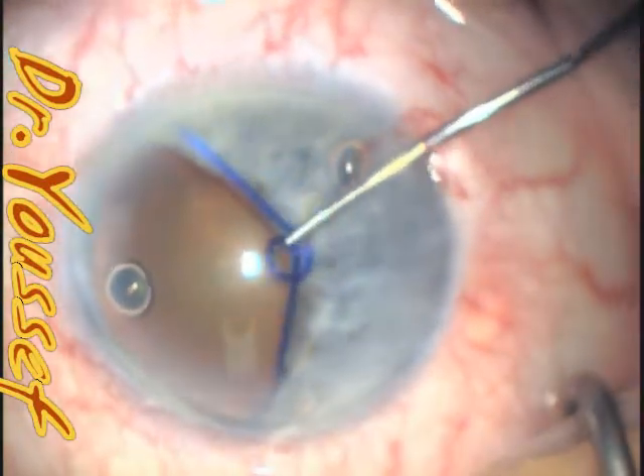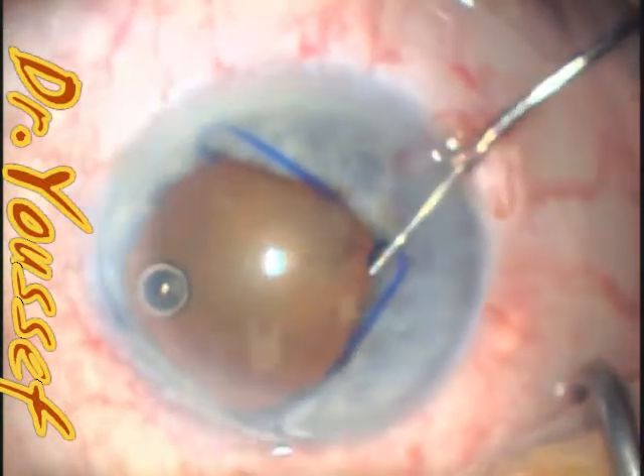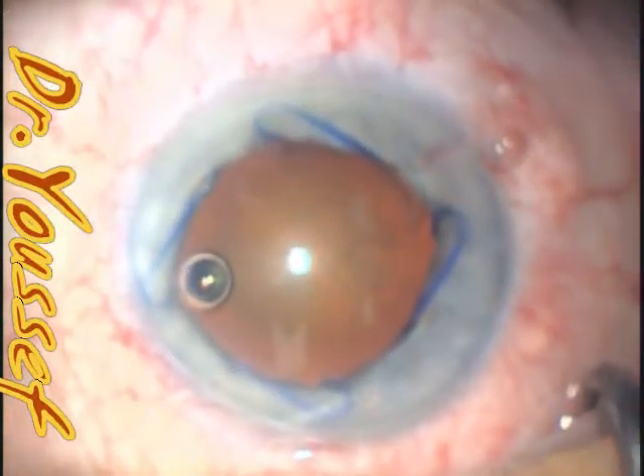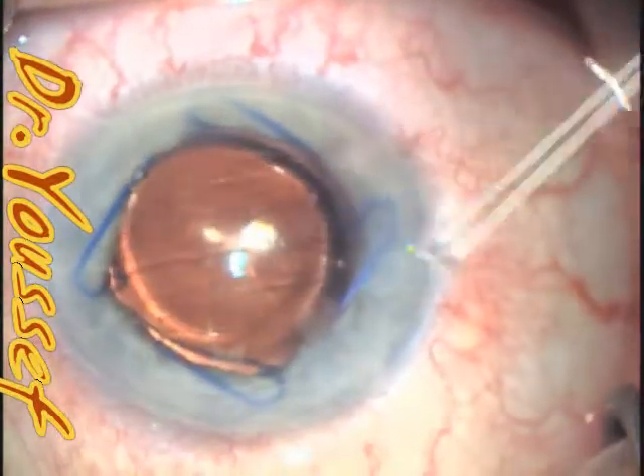My preference now is the McPherson because it controls it well. I'll see it slipping off the manipulator, so the best is actually to hold it with the McPherson and just place it directly. I'll put a video later for that.